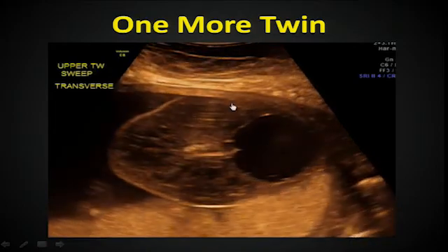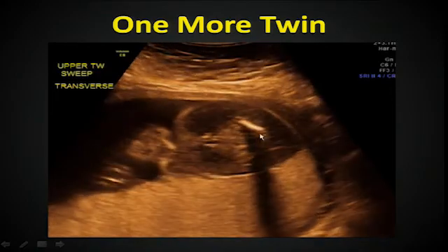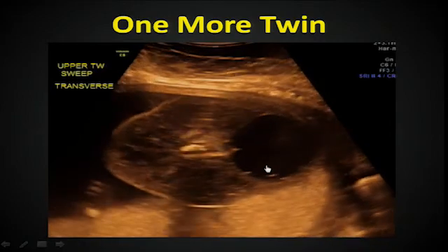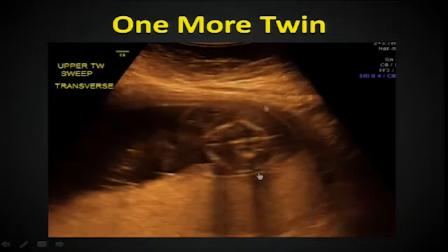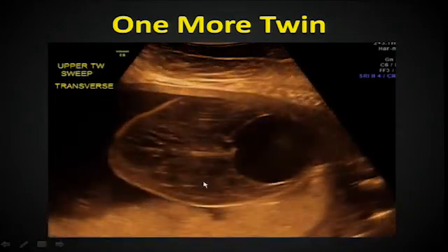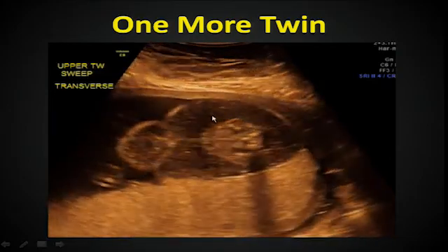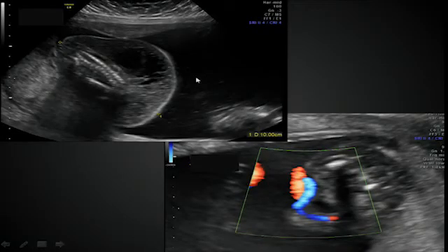All right, one more twin, our last case. So the other baby looked completely normal. This is the upper twin. We just referred in for abnormal second twin. What do we see? Well, there's a cystic structure. There it looks like the chest, part of spine. Look at all this tissue edema. Measuring the length, there's the spine from the torso to the area of the head. I don't see a calvarium. Does anybody else?